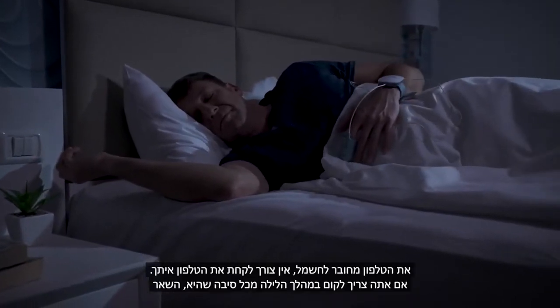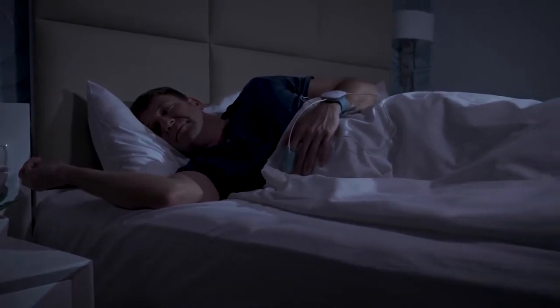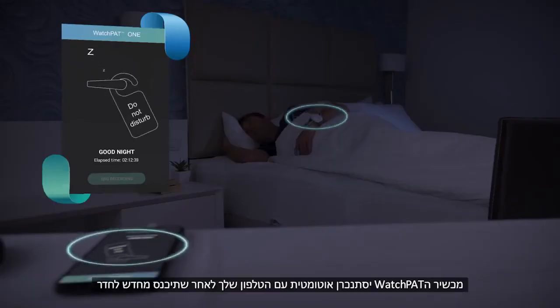If you need to get up during the night for any reason, leave the phone plugged in. There is no need to carry the phone with you. WatchPat will automatically re-sync with your phone once you re-enter the room.